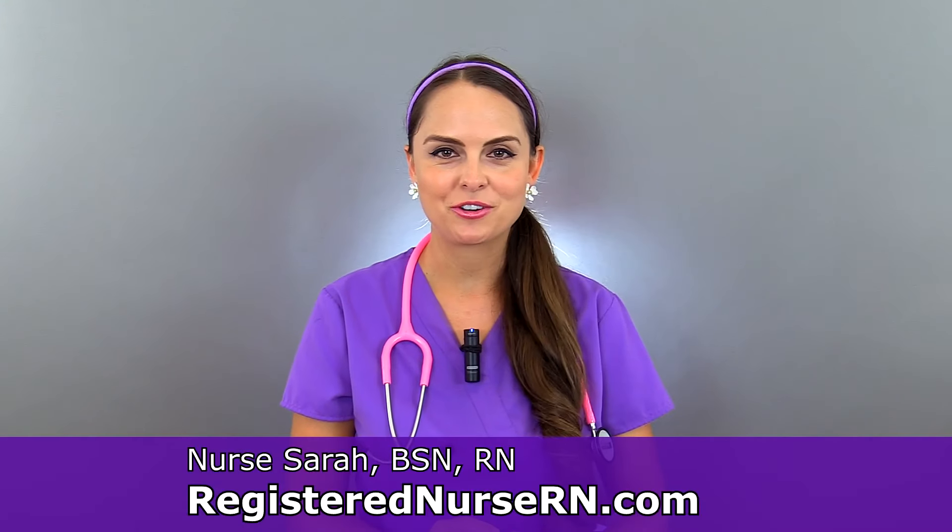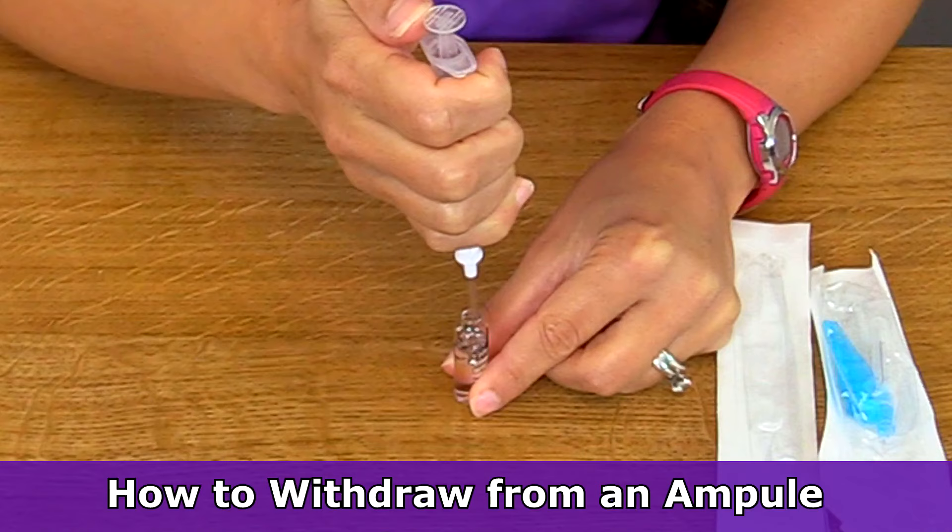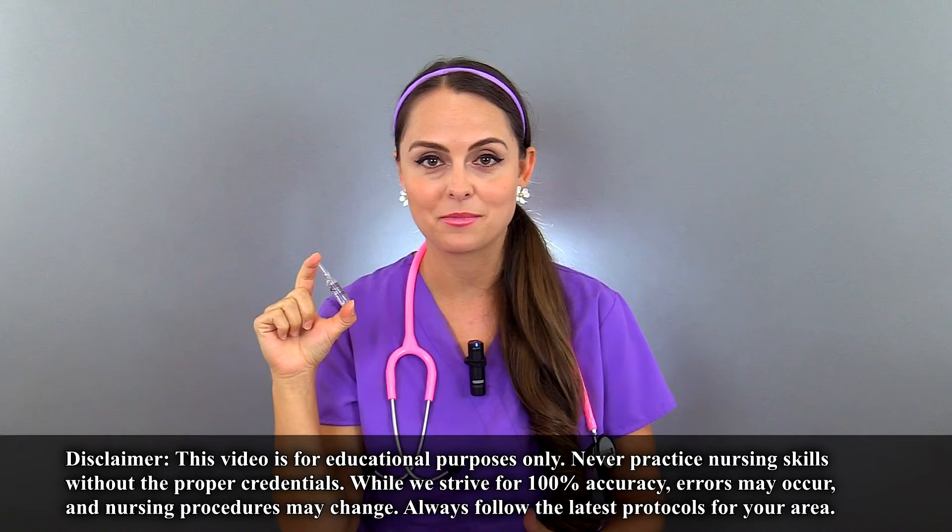Hey everyone, it's Sarah with RegisteredNurseRN.com and today I'm going to demonstrate how to withdraw medication from an ampule. As a nurse, you're going to be required to withdraw medications from glass ampules and you'll want to know how to break this ampule without getting hurt and how to remove the liquid medication that is inside of the ampule.